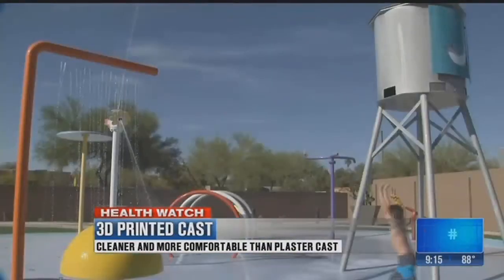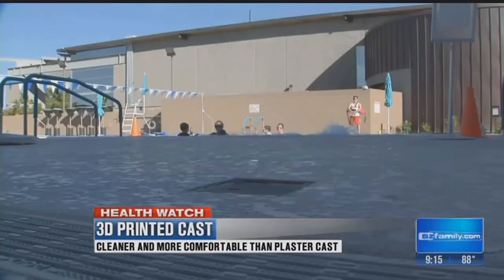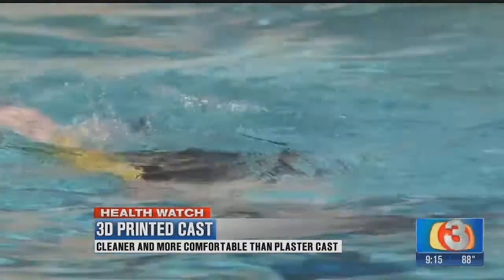But as you can see, Maddox is none of those things. Despite his broken wrist, this self-described active kid is running, jumping, and swimming — all thanks to a colorful but unconventional cast on his arm.